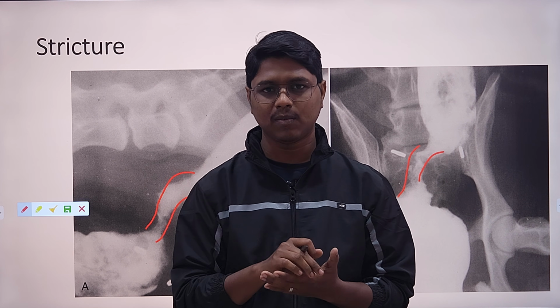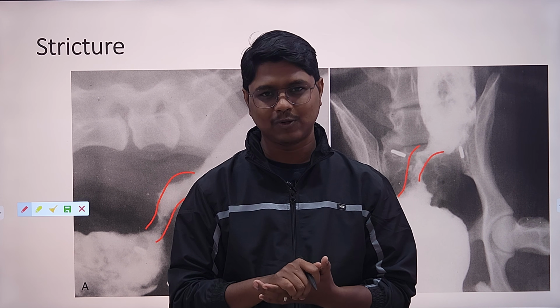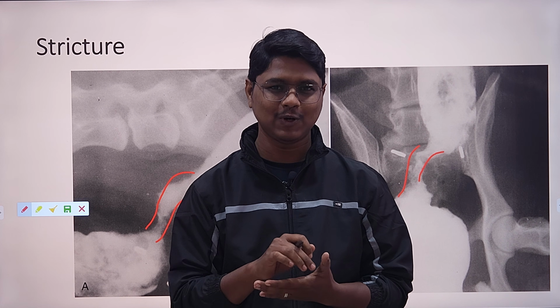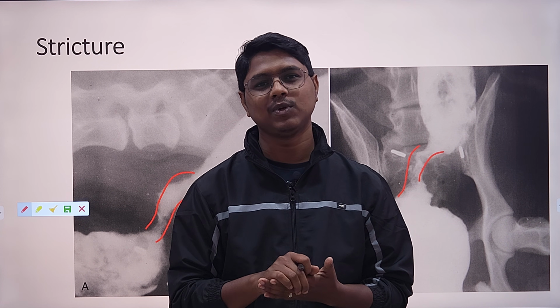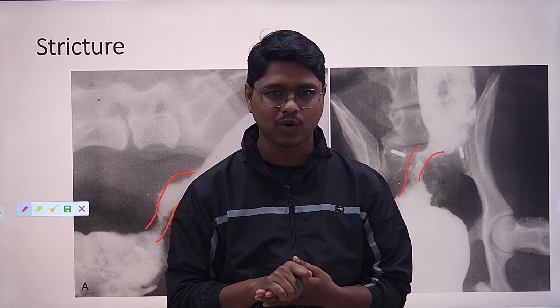So this is all about the radiography pathology of the large intestine and also the radiography pathology of the abdomen. In the next class we will go for the radiography pathology of the thorax.